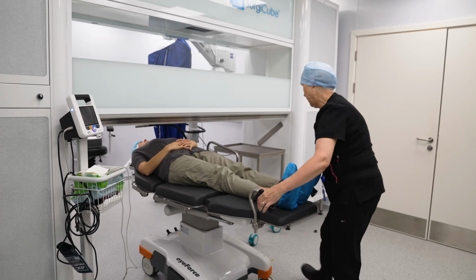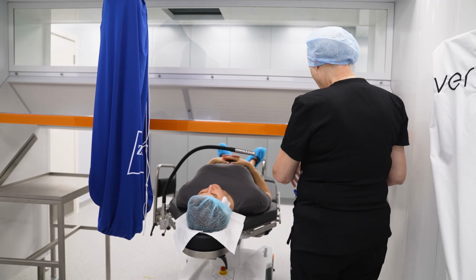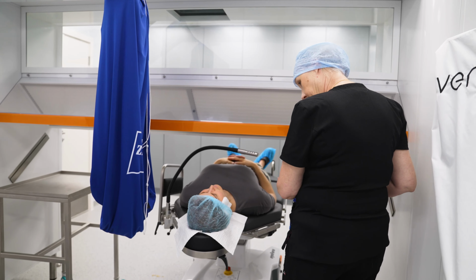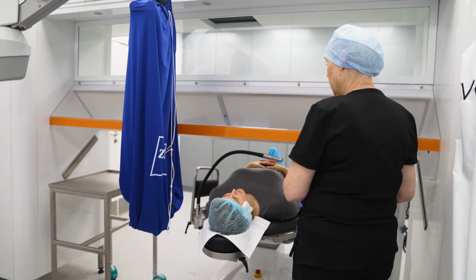We operate in what's called like a little cube, and one part of you is under the cube. Once we start the procedure, we make sure that your eye is completely numb again. We cleanse the eye, we put a drape over the eye that we're going to operate on, and then the surgeon puts a speculum into your eye, and it just holds the eye open. It's just like a little clip. Again, you won't feel any pain at all, but it just keeps the eye open so that you don't have to worry about trying to keep your eye open yourself.